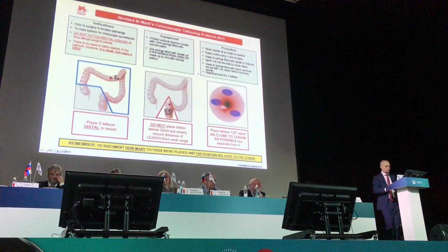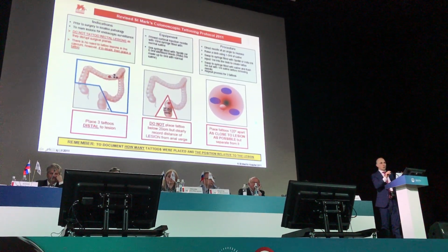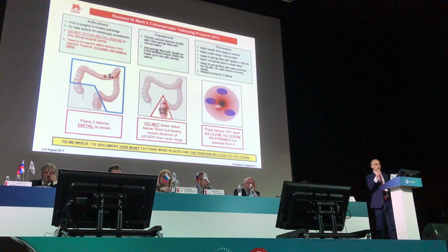The important part: if you see the first draw, you will notice that the cecum and the rectum are not included in the picture. Why? The recommendation is you don't tattoo the cecum and the rectum.